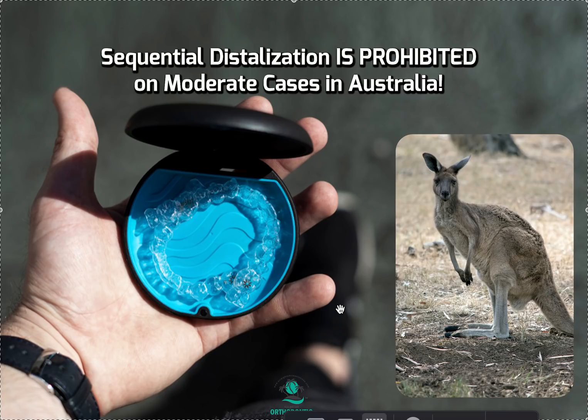So I'm very comfortable for very minor ones, 1, 2, 3 millimeters. It is an easy way to correct class 2, assuming nothing's impacted in there. So I've been using it on moderate all the time, 20 aligner cases in the US. I mean, just like super minor ones, right? And finishing the cases, no problem, not an issue.